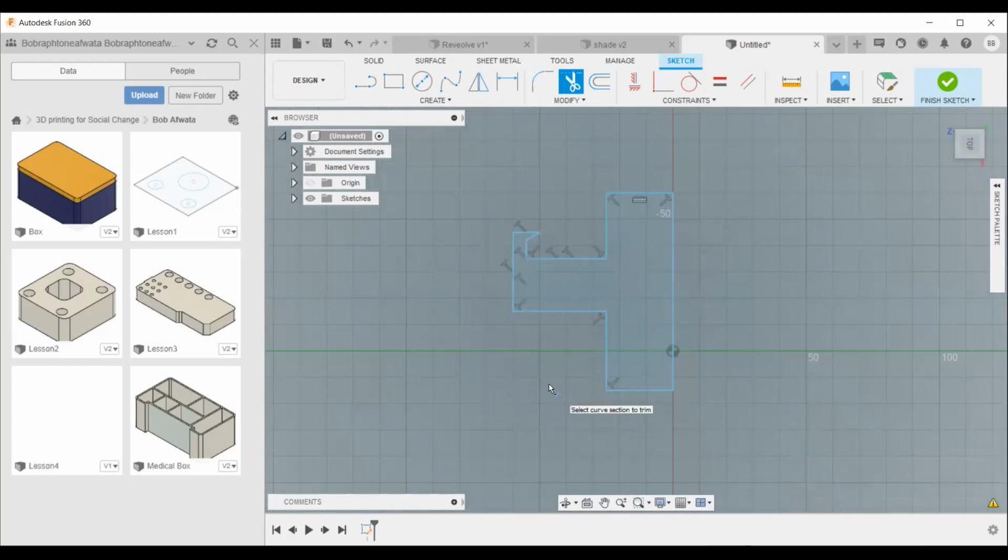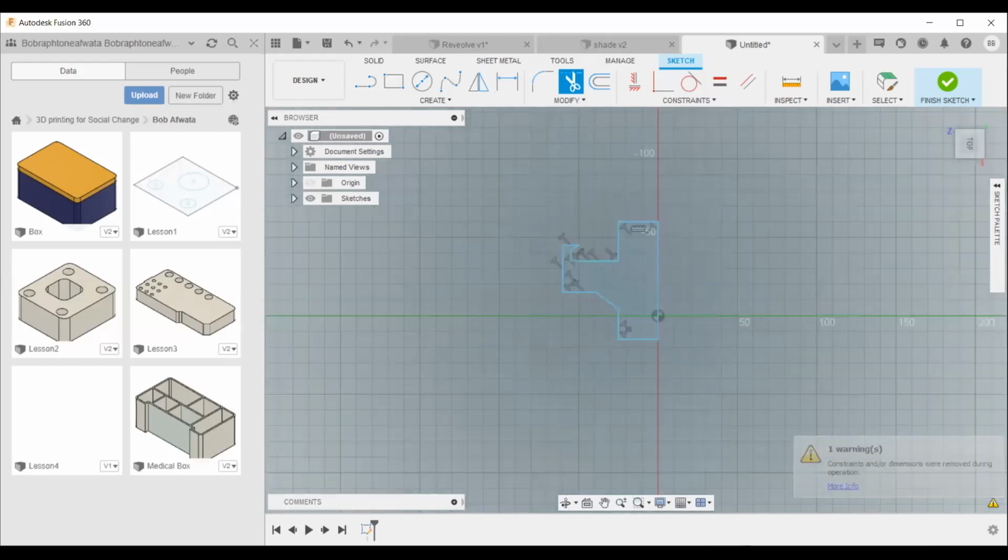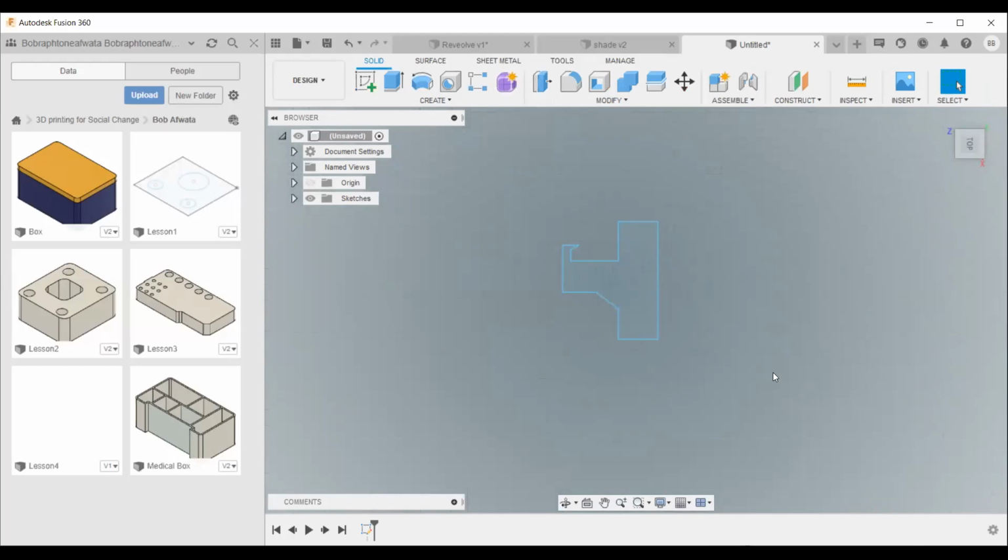Everyone, have you seen that? Yes. Then you can even do whatever you like. Alafu nakata hapo. So it's some random side shape. Okay. Then you finish sketch. I'm just buying time so that people like Elizabeth can do this and understand how Revolve works.